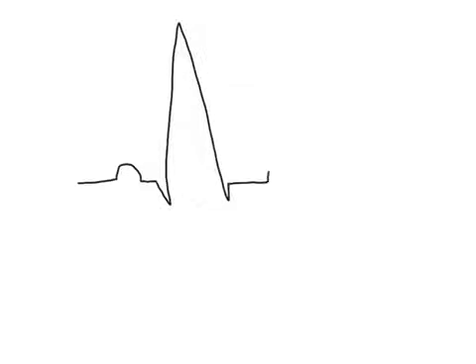One of the objectives that you need to do is to be able to draw an EKG. Now, you're not going to have to draw an EKG per se, but you need to understand the parts of an EKG. So if we draw it, it'll make it easier to learn. So when we draw it, we have a nice straight line. We get a small inflection, a short flat line. We go down, big up, come down again. And then the third peak is bigger than the first, but smaller than the middle one.